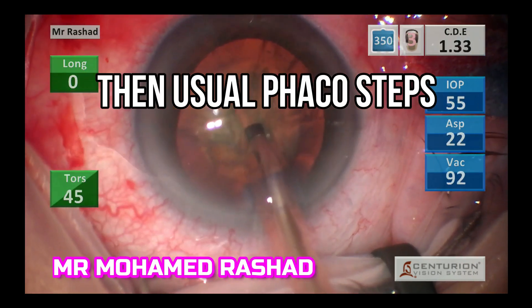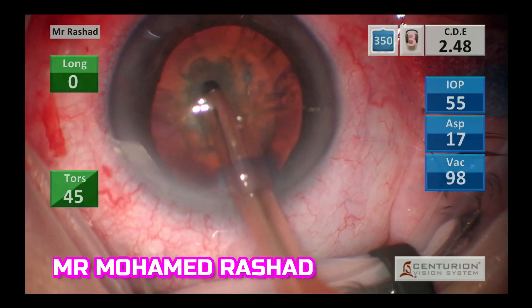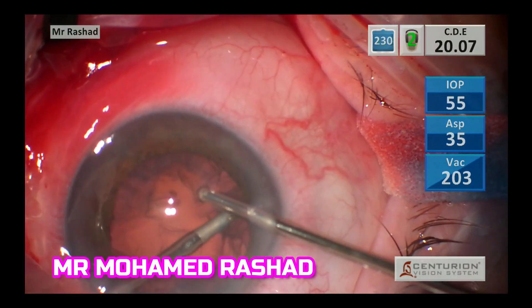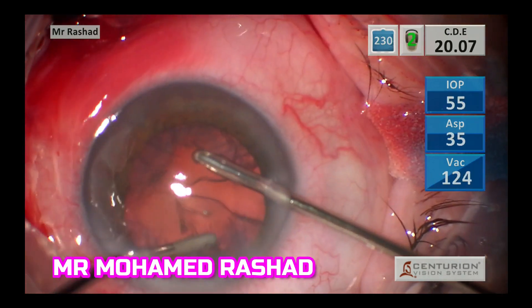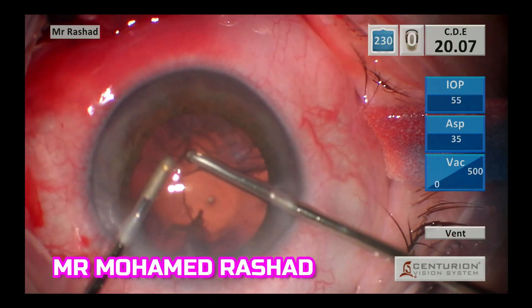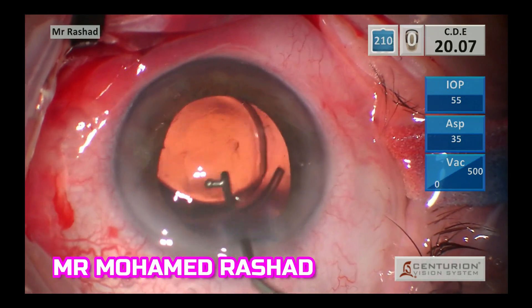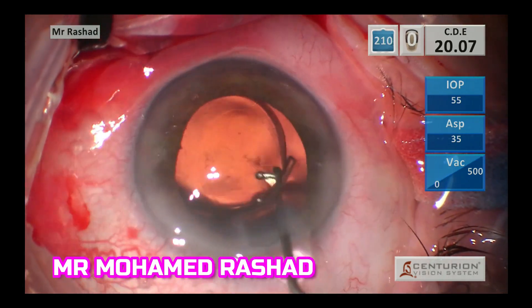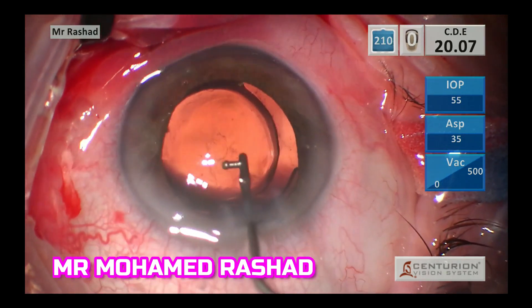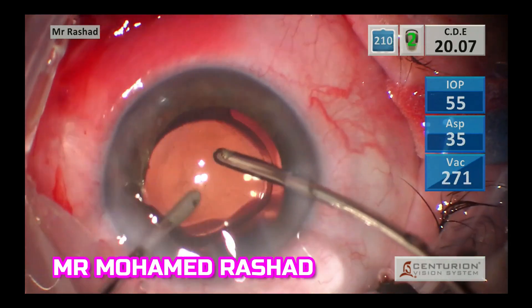Then you do any phaco technique for nucleus removal. The most important thing in these uveitis cases is to remove all the cortex to avoid postoperative uveitis, and implanting the hydrophobic intraocular lens to avoid any inflammation as well.